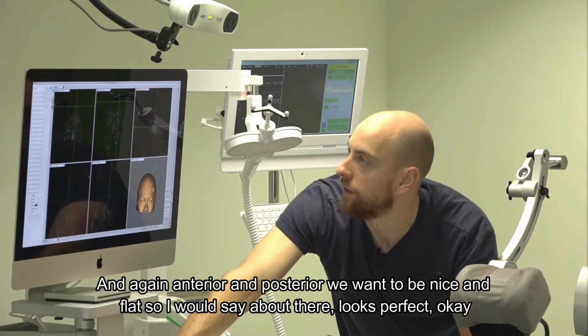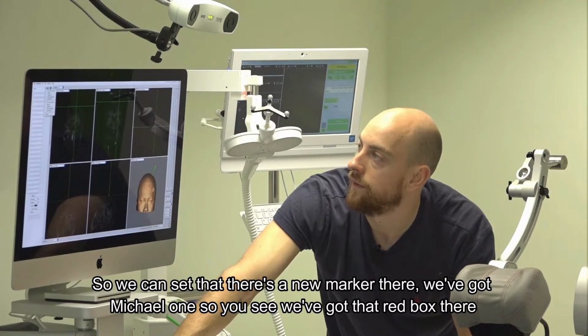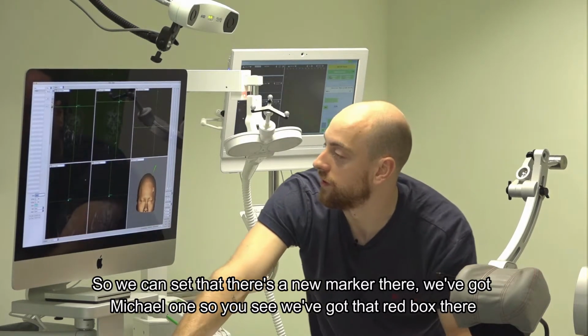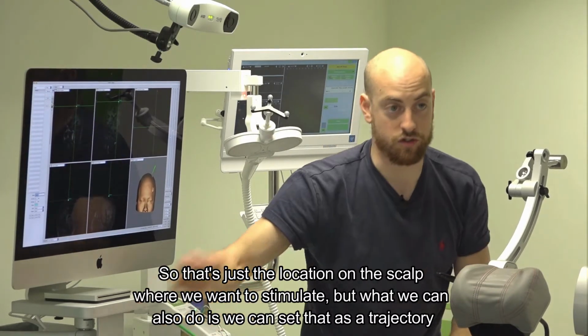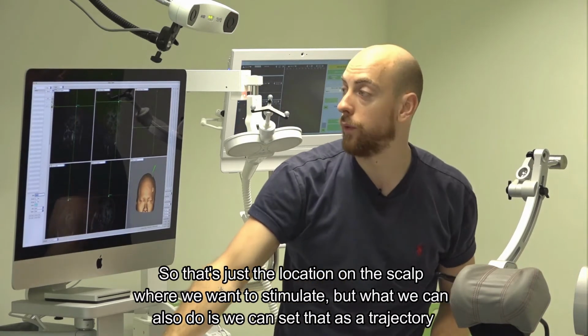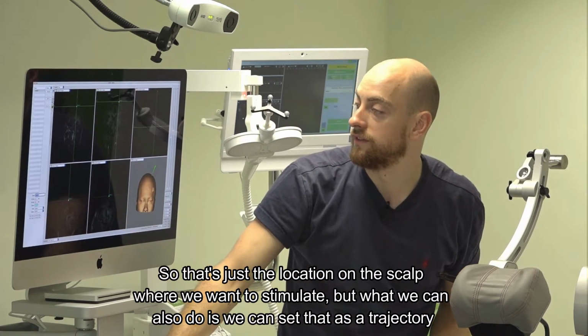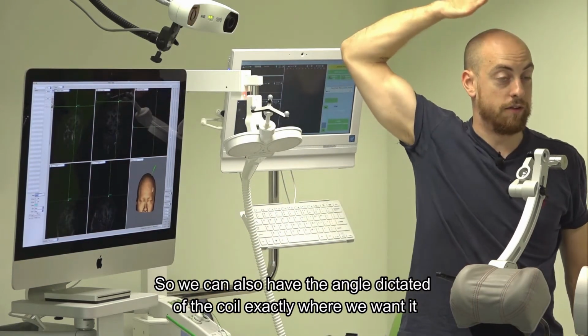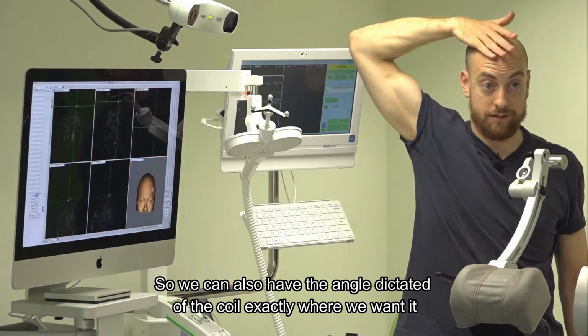Looks perfect. Okay, so we can set that as a new marker there. We've got marker 1. So you see we've got that red box there. That's just the location on the scalp where we want to stimulate. But what we can also do is set that as a trajectory, so we can also have the angle of the coil dictated exactly where we want it.